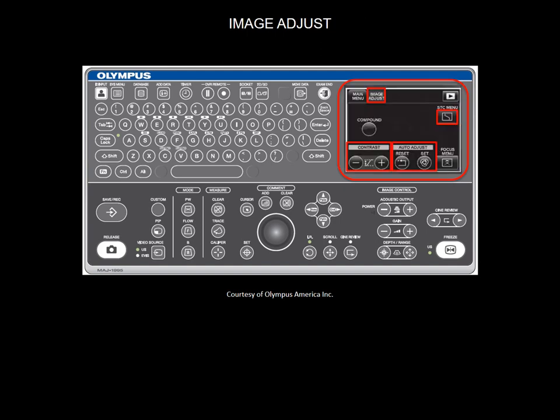The image quality can be adjusted using GAIN, CONTRAST, ENHANCE, and STC, which stands for sensitivity time control.